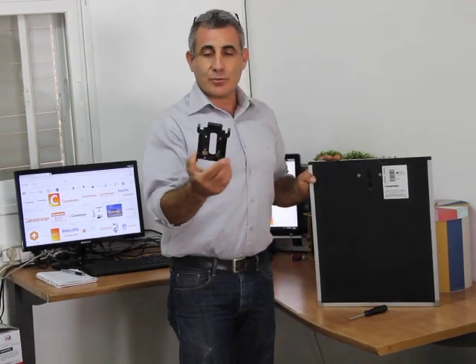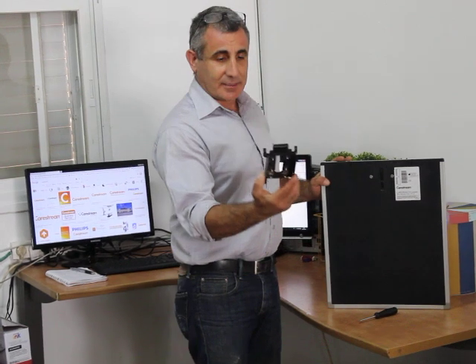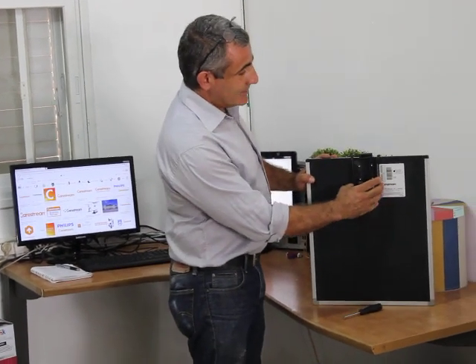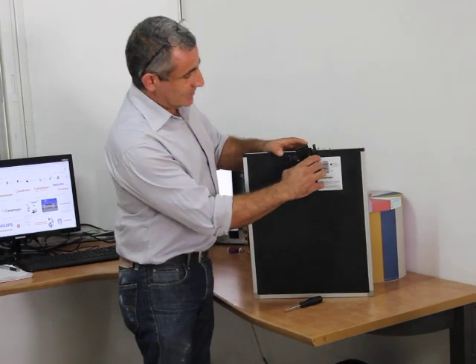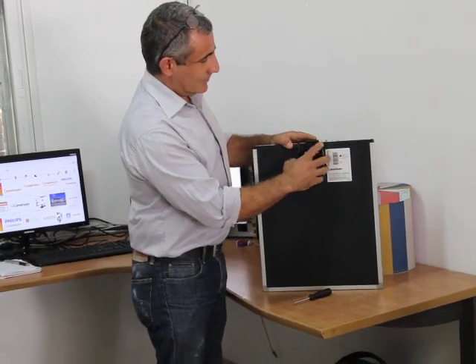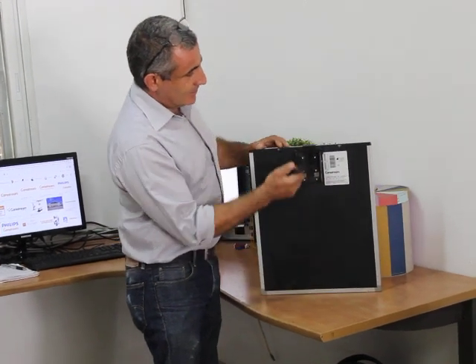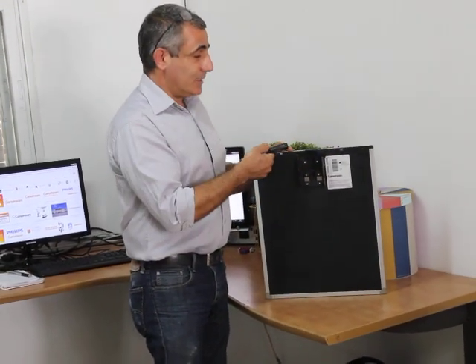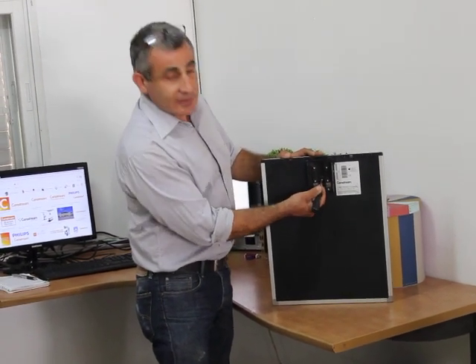First I will show this is a special made extraction tool made by Kerstrim. You place it here in the center, push it down, pushing down until it locks and then by pushing down it will open the shutter.